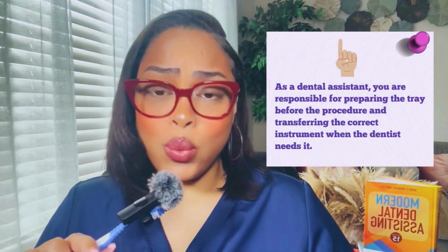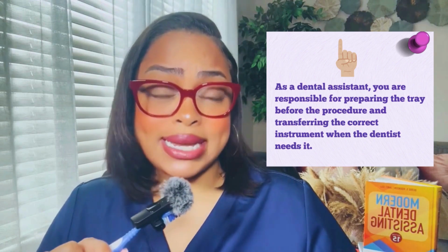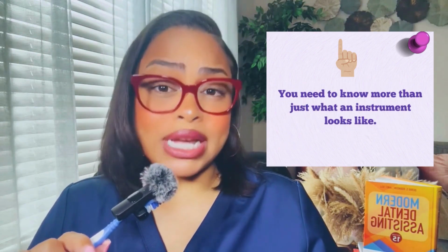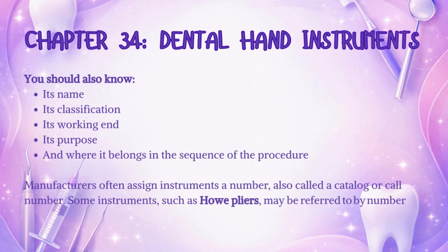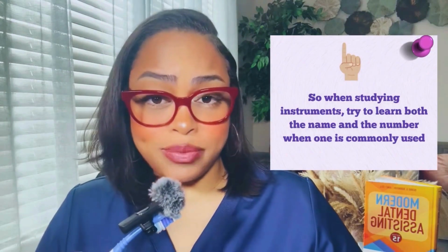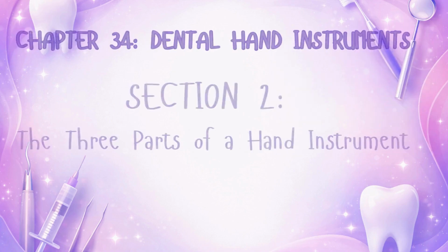As a dental assistant, we are responsible for preparing the tray and transferring the correct instrument to the dentist when needed. That means you need to know more than just what an instrument looks like. You should also know its name, its classification, its working end, its purpose, and where it belongs in the sequence of the procedure. Manufacturers often assign instruments a number, also called a catalog or call number. Some instruments, such as Howe pliers, may be referred to by number more often than by name. So when studying dental instruments, try to remember the name and the number of the ones that are most commonly used.